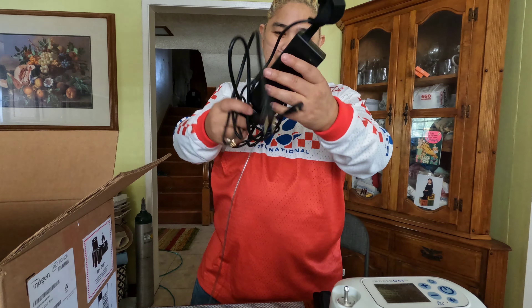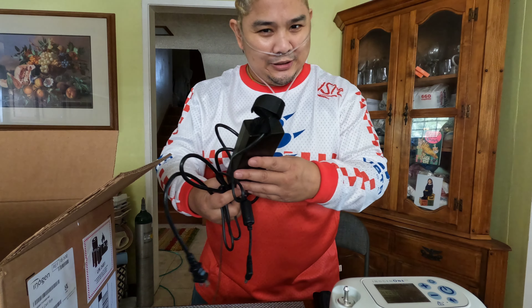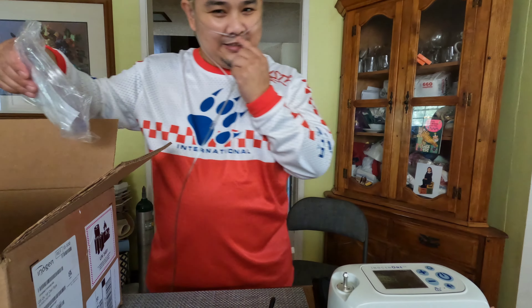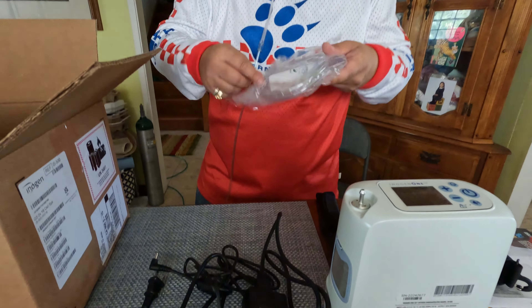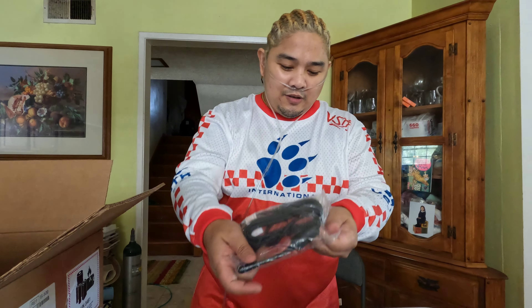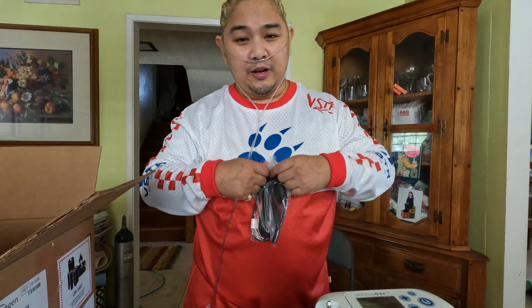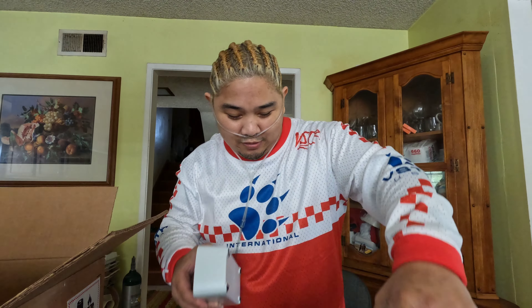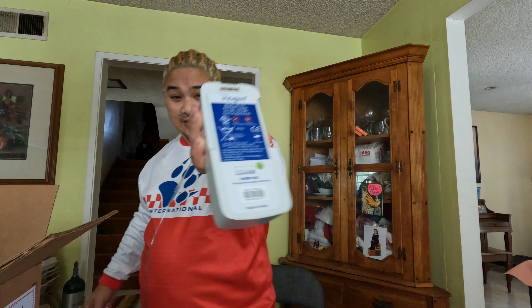You also have what comes along with it: a battery charger. We got one of these cannulas for your nose — putting inside your nose. Guess what else we have? Car charger — you need this when you're on the go. And last but not least, the second battery. I put the first battery on early; it's charging to get 99% battery. This is the second battery.